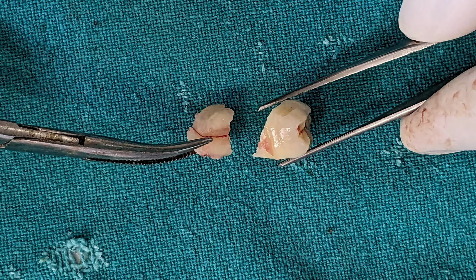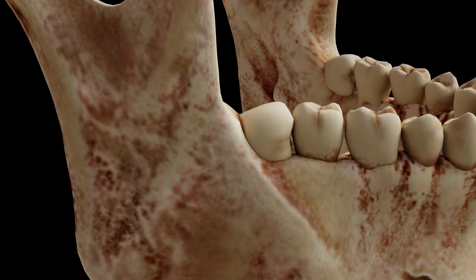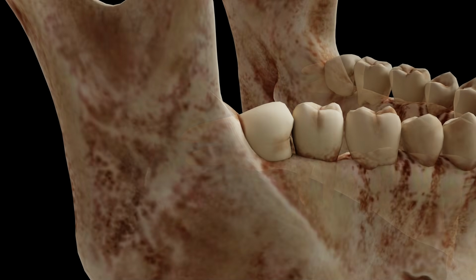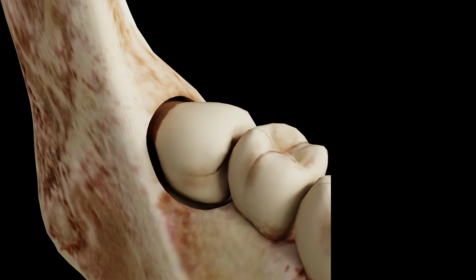Now comes the step where I section the tooth. But before I show you how to section the tooth during a surgery, let me explain it to you with the help of a 3D animation. I have created this 3D mandible with an impacted tooth. You can see that the third molar is horizontally impacted and is locked by the second molar. Let's zoom in further. As always, I first create a gutter, buccal and distal to the impacted tooth.